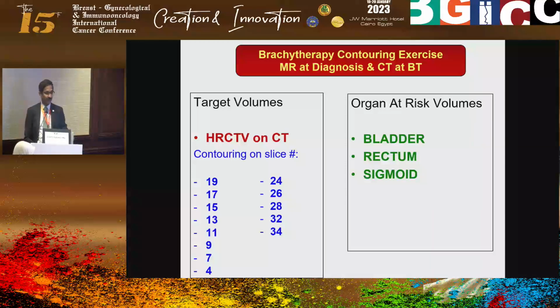I have written contouring on these slices, and I have put this sequence because when you start contouring, always start from a slice where everything is clear to you. Okay, go down and go up. So go from an area where everything is clear about the contour, above, below. And that is why I have given these slices. So where to see the slices, I will just show you now.